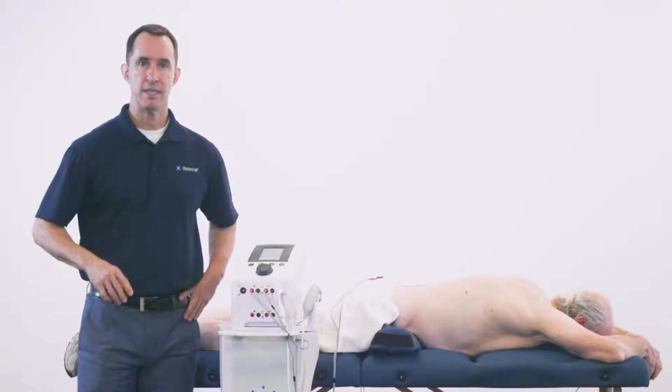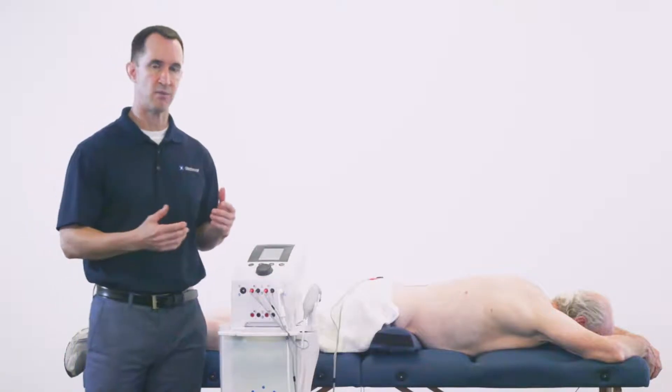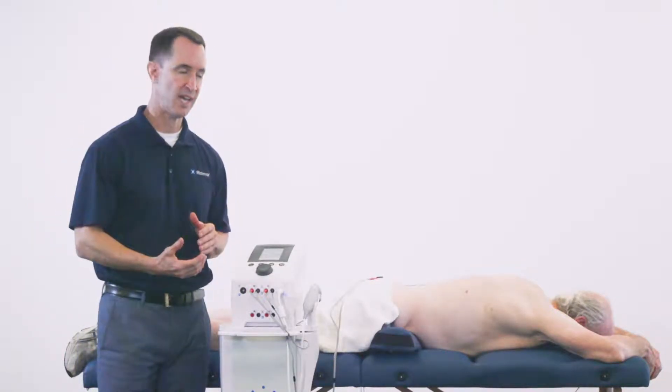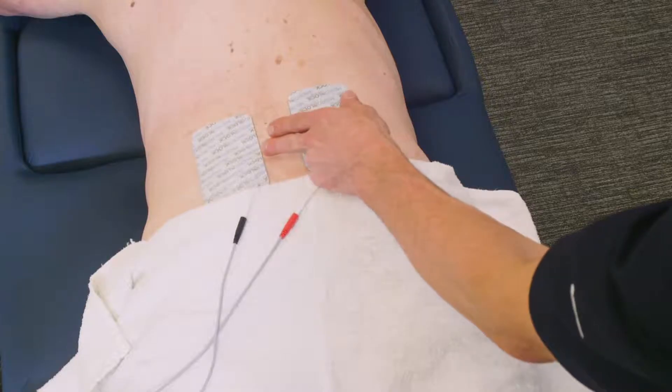The clinical example is chronic pain and spasm of the low back. With the premod, we're using a two-pad placement with a single channel on the low back.